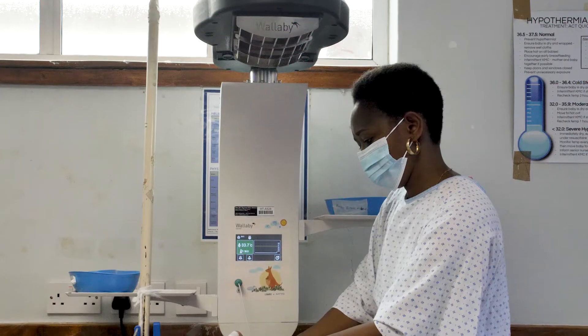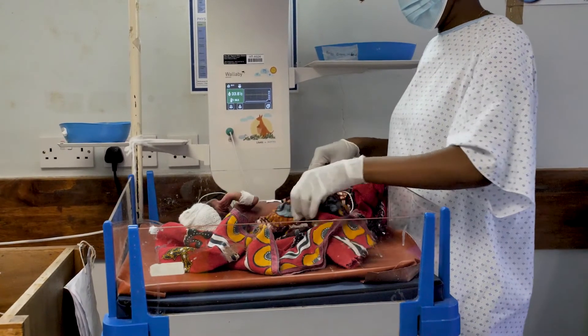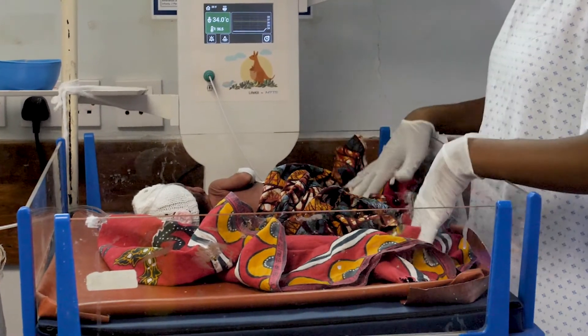If you do have to use the warmer for more than one baby, then there must be constant monitoring. You can use the temperature probe as a thermometer to take the temperature of the babies, or you can use a thermometer. Ideally, the warmer should always be in servo mode when warming a single baby. If you have to warm more than one baby, it is best to have it in manual.